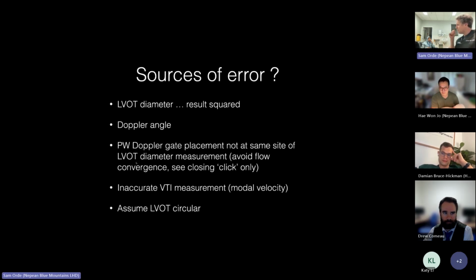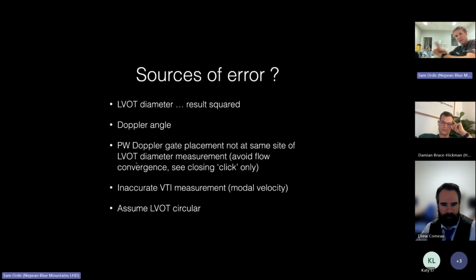So I always have Emma in my mind, where you put the color Doppler over your LVOT. You need to see where it starts going red as it goes into the acceleration. You want to be just behind that area where it's red, the PISA, going into the zone of acceleration. So she describes it as being in the blue.